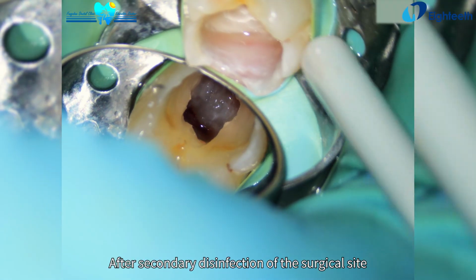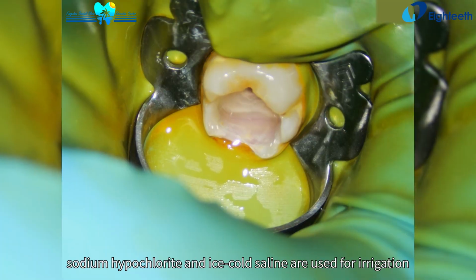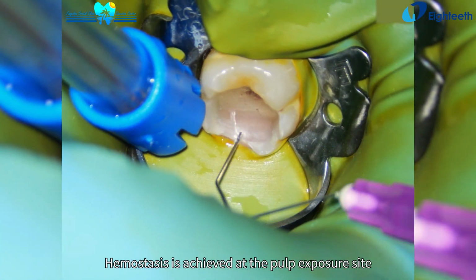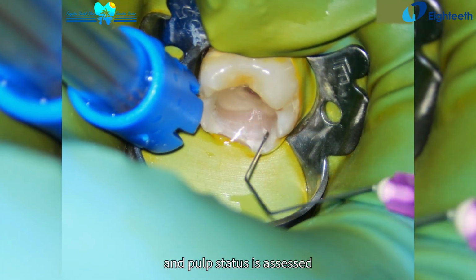After secondary disinfection of the surgical site, sodium hypochlorite and ice-cold saline are used for irrigation. Hemostasis is achieved at the pulp exposure site, and pulp status is assessed.